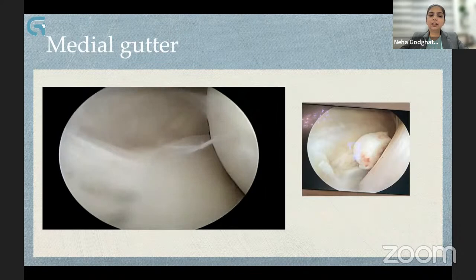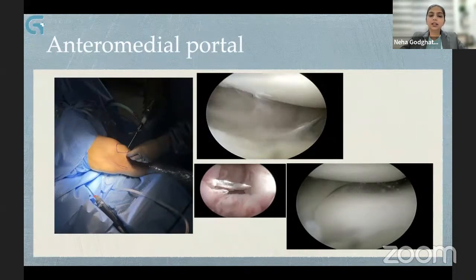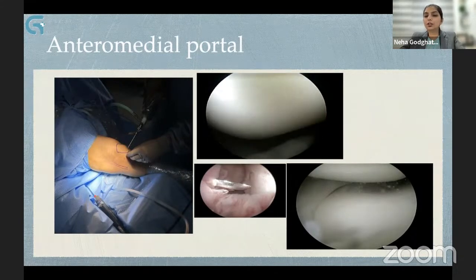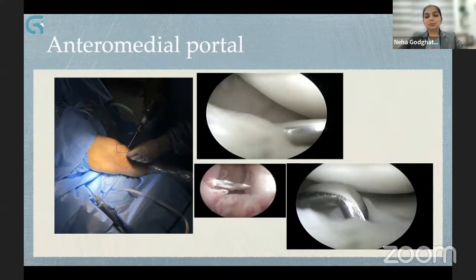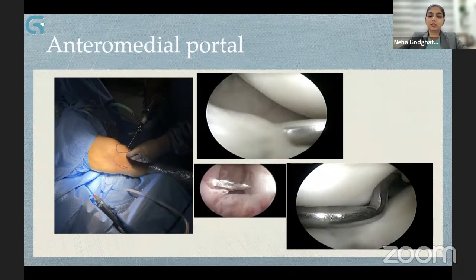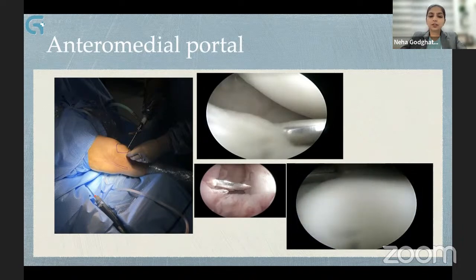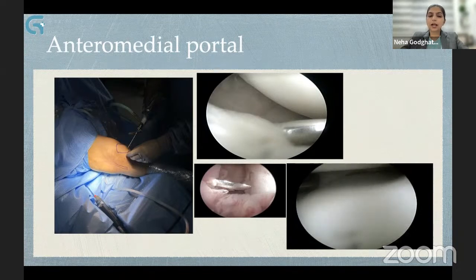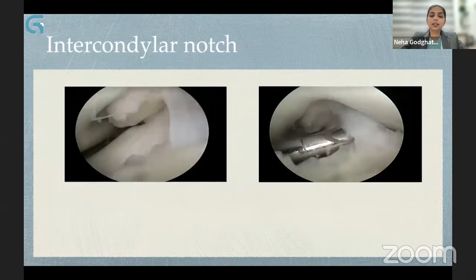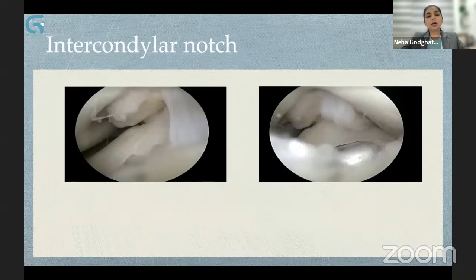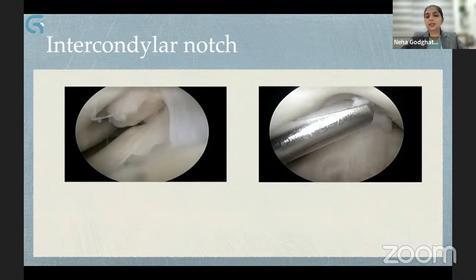The first picture you see once inside the suprapatellar pouch — the scope is gradually withdrawn to see both femoral condyles, and patellar tracking is checked by gently flexing the knee. The scope is then glided into the medial gutter — these capsular reflections are the medial gutter, an important spot to locate loose bodies. After that we enter the medial compartment of the knee. The anteromedial portal is made with a needle using the outside-in technique, just superior to the meniscus, with care not to injure the meniscus or articular cartilage. A stab incision is made and the probe is inserted — the probe is basically the extended finger of the surgeon.